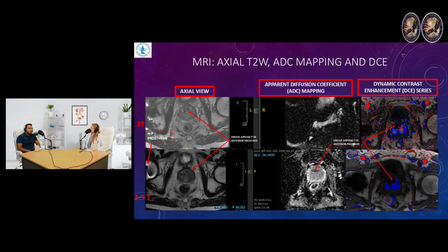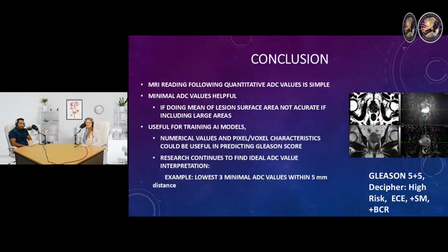The other thing to think about is, obviously, if you have choices of where that patient can get scanned. If they have Urolift clips or a hip replacement or something, getting scanned on a 3 Tesla magnet will be worse off, but they might still be able to get scanned on 1.5 and still get pretty good information. So having those options, if you can send your patients to certain places, might be pretty beneficial. Less magnetic field strength means less distortion of the image. Okay, next slide.